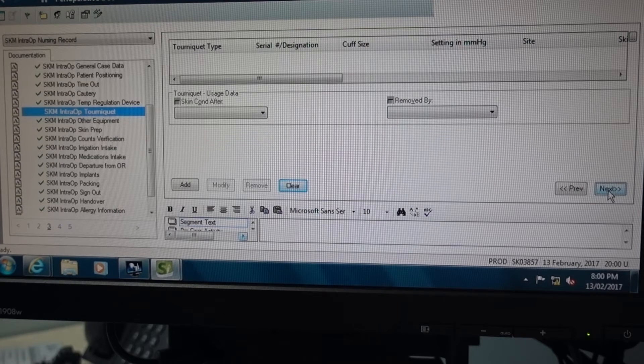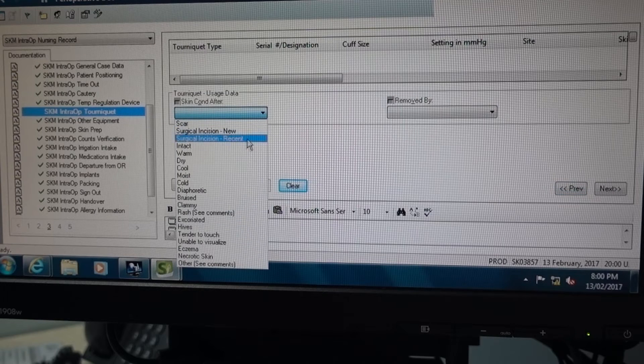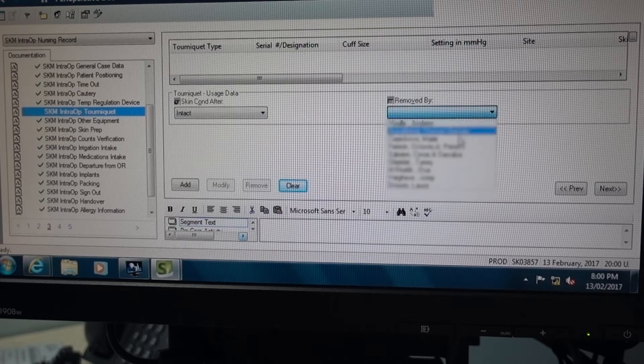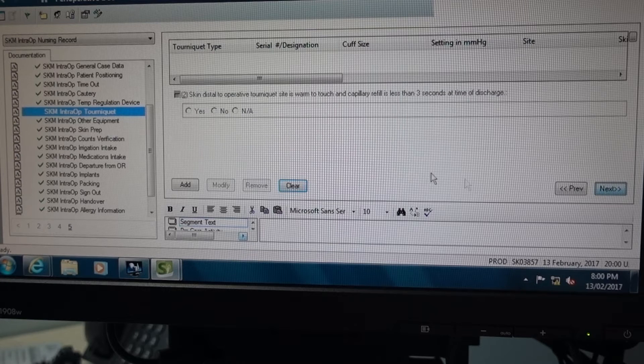Next, set the time you started inflating the tourniquet, then the time it was deflated. Next, document the skin condition after you remove the cuff and choose who removed the cuff, then click next. Now your assessment of the distal pulse, then hit next again. This part is your assessment of the skin temperature, and at the bottom you can document anything observed that needs to be handed over regarding tourniquet use.